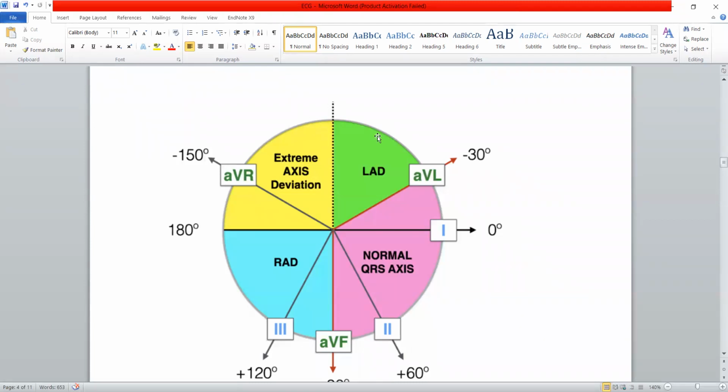this circle. And remember that lead 1 is on the left side and lead AVF is on the inferior side, on the left foot. Just remember this circle. You do not need to remember the thumb rule if you remember this diagram. Thumb rule is basically cramming for axis deviation. But this method is very easy if you make your concept clear.